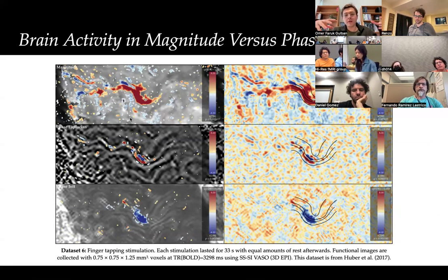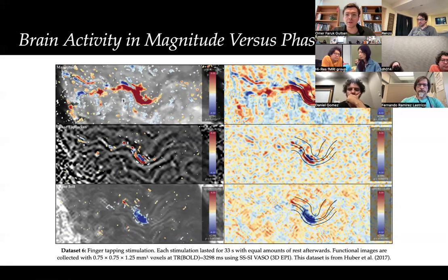That's why it pops up, and this is definitely a macro vein, a pial large vein. I know that from the data. Of course, it spreads around a little bit, and you can use this to regress out from the data, so it will be a bit cleaner over there. But it's not like you all of a sudden get rid of oxygenation effects in your gray matter. For instance, with VASO, it tries to kill the signal from the arterial blood from an acquisition point of view. And this is in line with Ravi's methods and his papers, you mitigate the large pial vein effects.